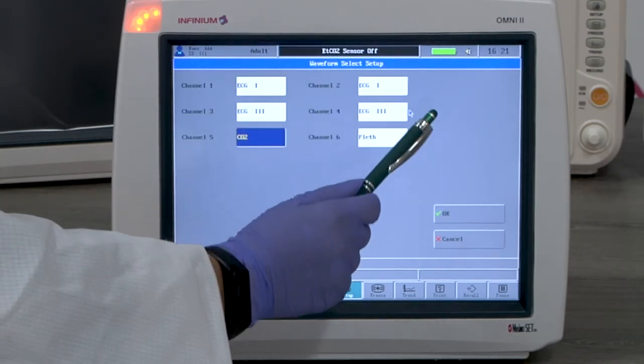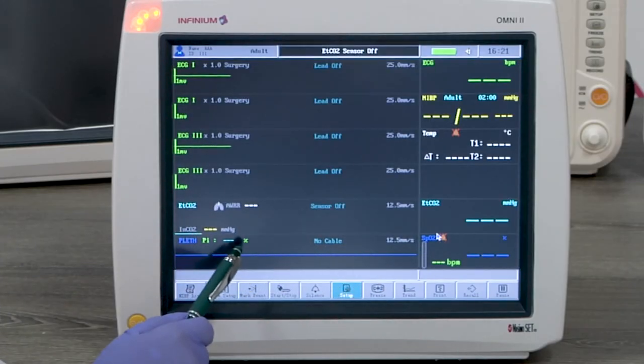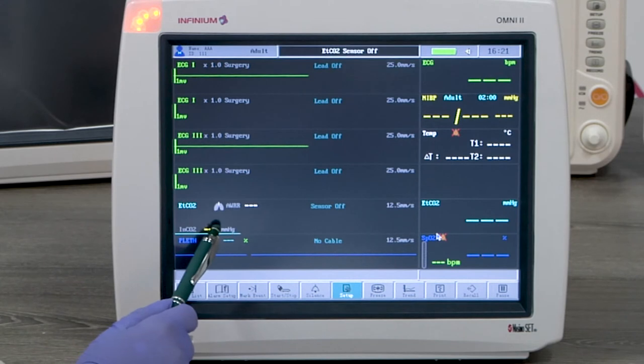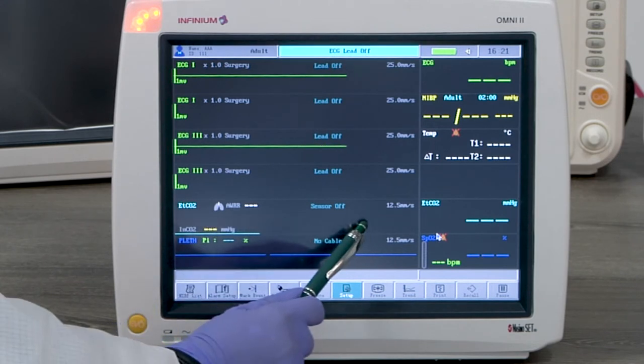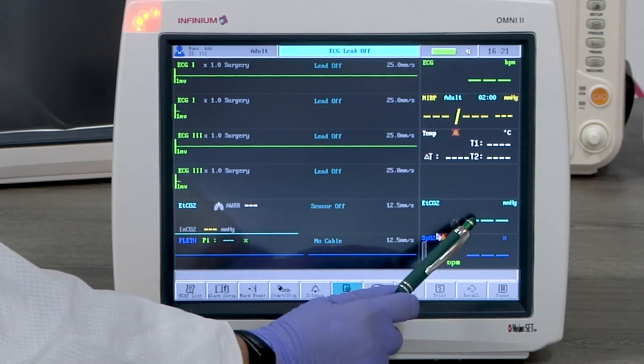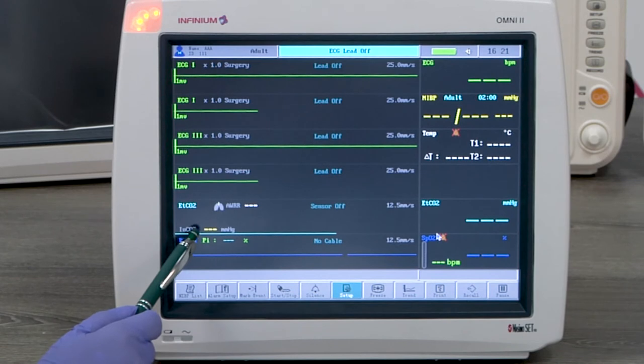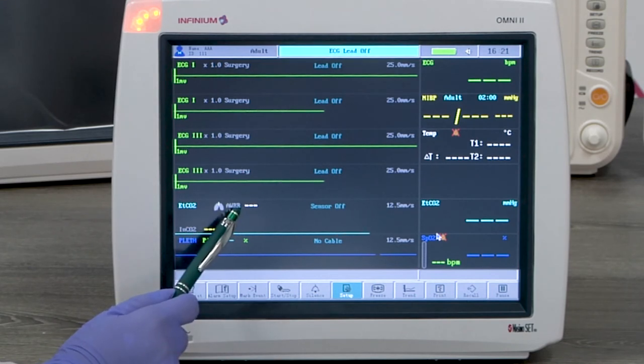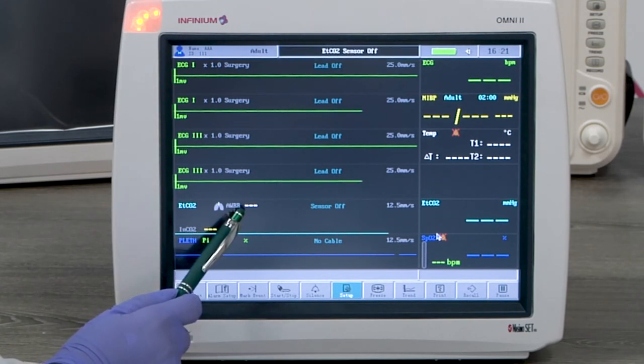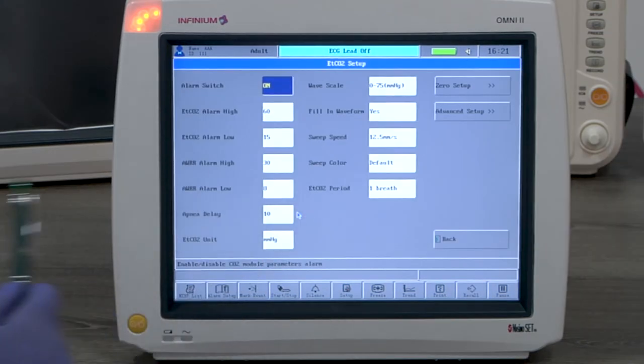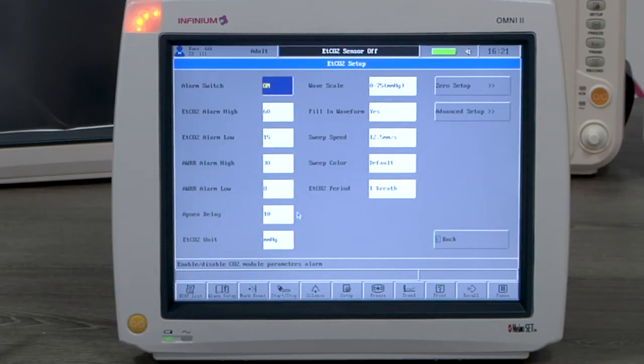On the CO2 channel, it shows the end tidal CO2 waveform, end tidal CO2 reading, inspired CO2 reading, and airway respiratory rate. Tapping anywhere on the CO2 channel will enter the CO2 setup menu. The setting can be changed according to the user's preference.